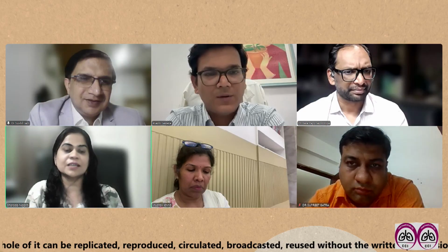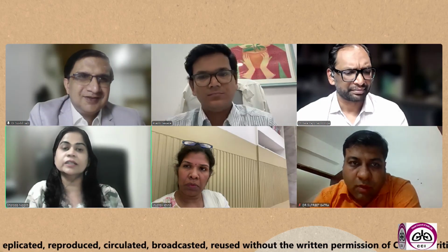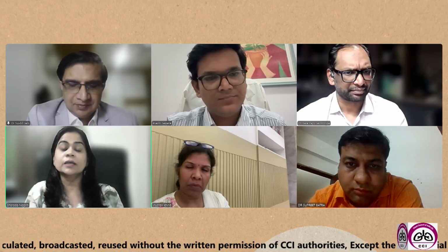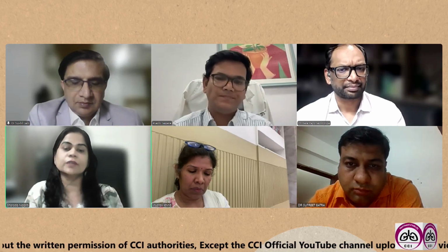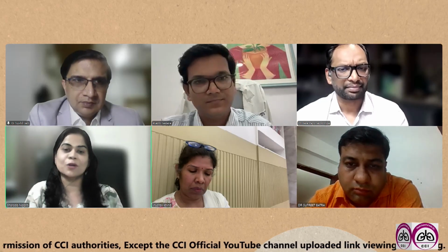The third one is, as I've already said, don't waste any material. Whatever material is there, even the needle, as Dr. Pravin rightly pointed out, even the needle also has to be rinsed with normal saline or air, and the material that is left over in the needle rinse is also very helpful, whether it is needle rinse material, blood clot, excessive blood, or even tiny fragments. Please put all the material in the fixative and send it to the lab for processing.